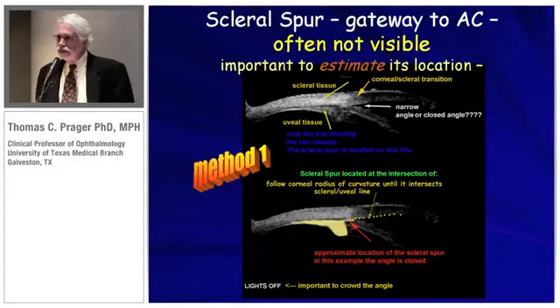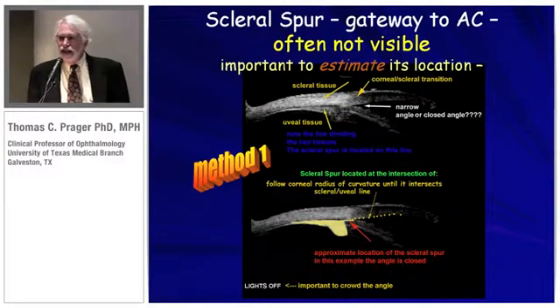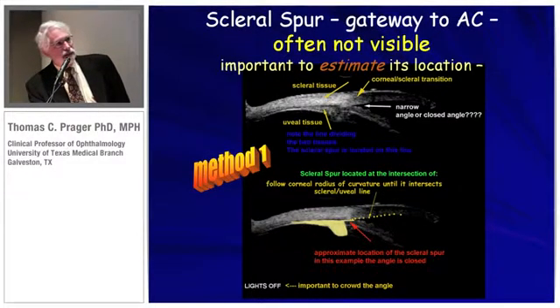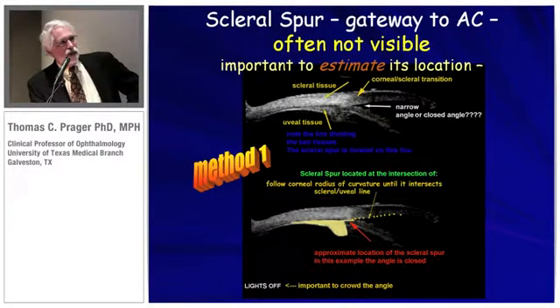The scleral spur is the gateway to the anterior chamber — it's an elevated circular ridge. It's very subtle and often not visible when you're doing ultrasound; its location has to be estimated. Scleral tissue is different from uveal tissue, and in ultrasound wherever there's a difference in tissue structure you're going to see a line of differentiation. We know that the spur is somewhere on this line, so I turn my gain down enough to see the difference between these two types of tissue. One method is to follow the curvature of the inside aspect of the cornea until it meets that line — that's one way to approximate the location of the spur.